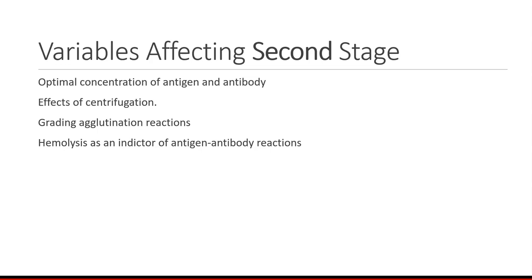At the same time, we need to gently dislodge that button off the bottom of the tube. So in order to do this, the scientists have to determine the optimal RPMs and the optimal amount of time to spin the reactants. And you always follow the manufacturer's instructions because they may differ from reagent to reagent.